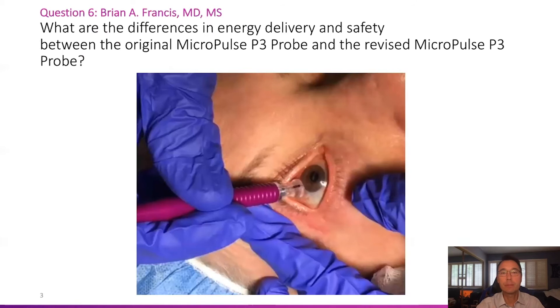Here is a patient being treated with the version one probe, and we'll go over a quick case study on the version two probe.